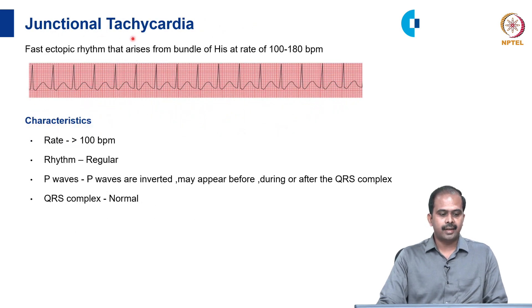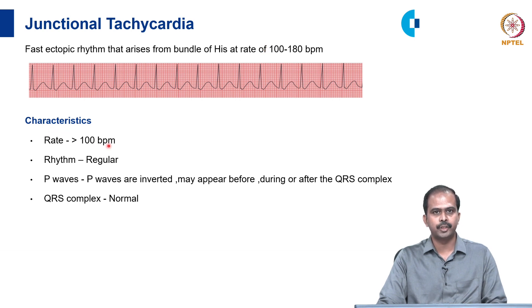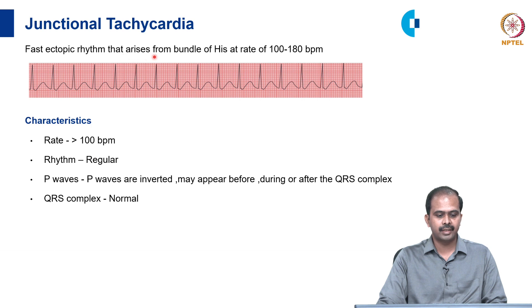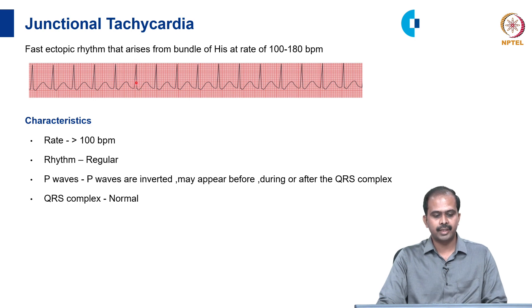Junctional tachycardia is a fast ectopic rhythm arising from the bundle of His at a rate of more than 100 beats per minute. It has a regular rhythm with inverted P waves appearing before, during, or after a normal QRS complex. In this ECG, there are 2 big boxes between R waves, so 300 divided by 2 equals 150. The P wave appears after the QRS complex and the QRS is normal. This is an example of junctional tachycardia.